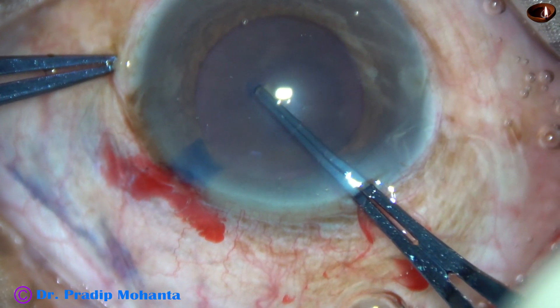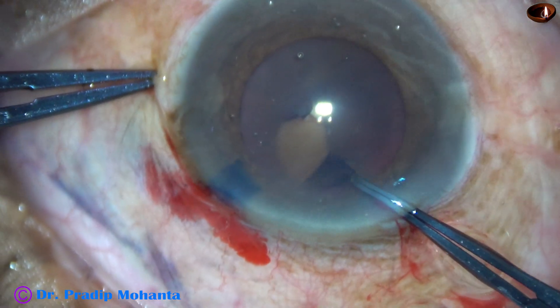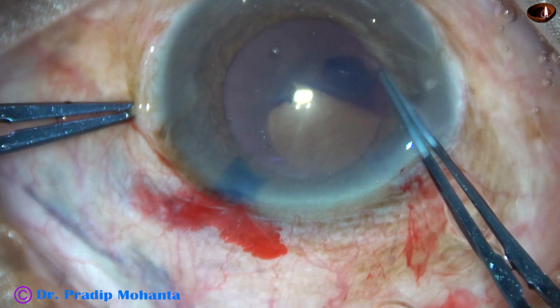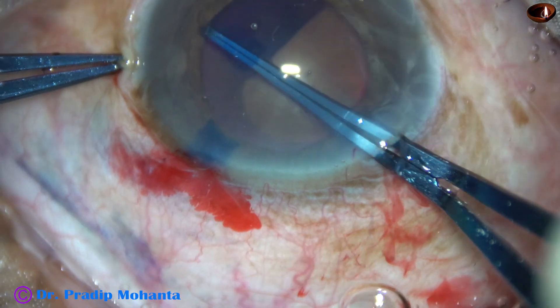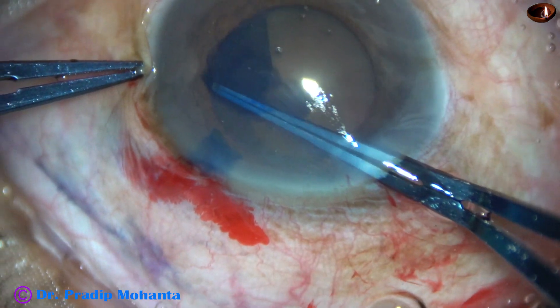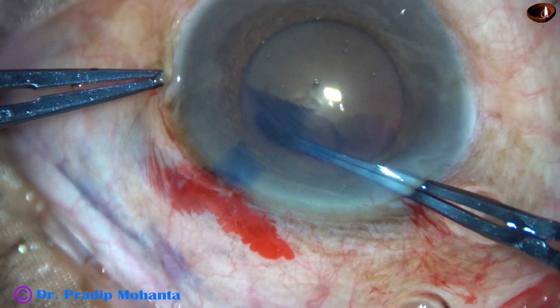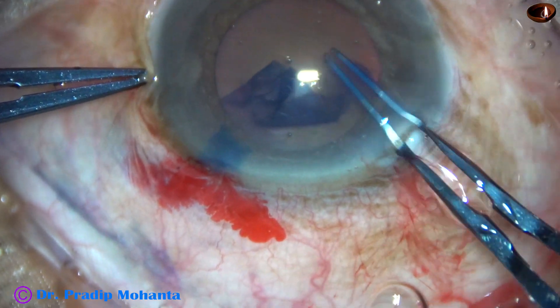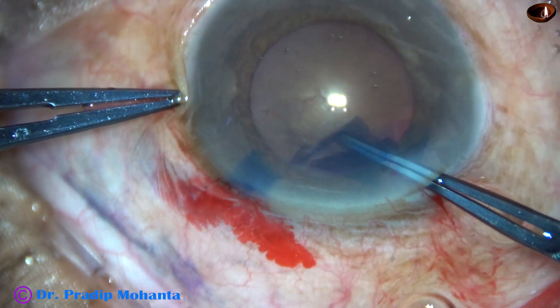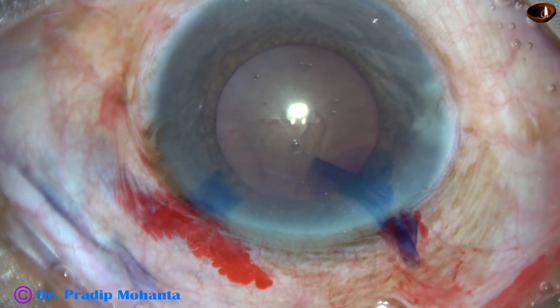This is the second case. The pupil is not well dilated — this is a mid-dilated pupil. This cataract appeared red on slit lamp, so we can call this cataracta rubra. So in this video we are going to see two very hard cataracts: the first case is cataracta nigra, and this second case is cataracta rubra — black cataract and red cataract.